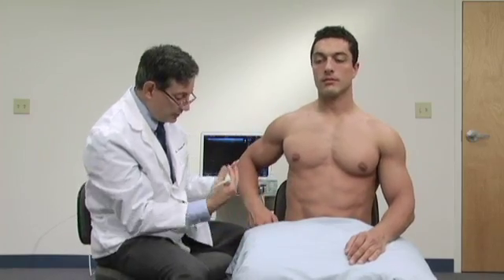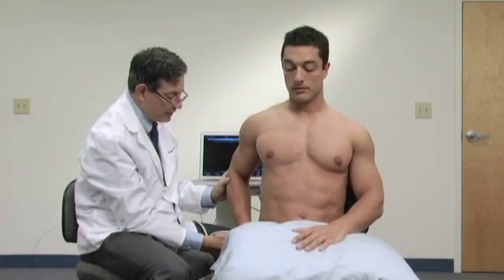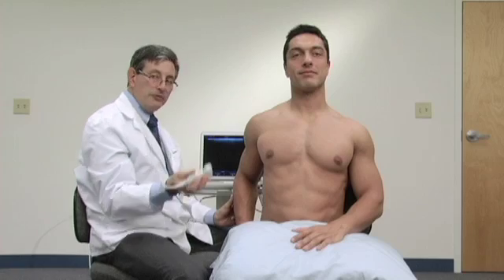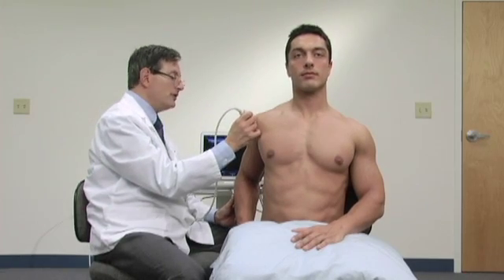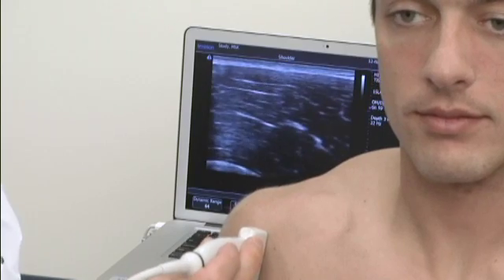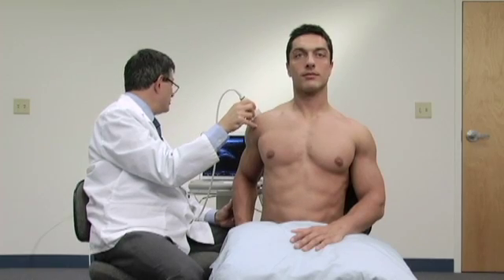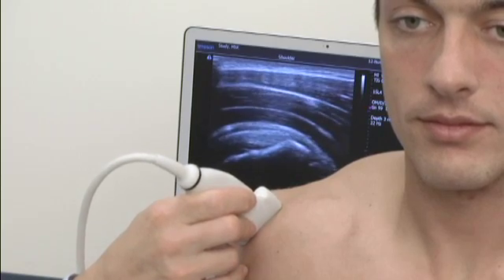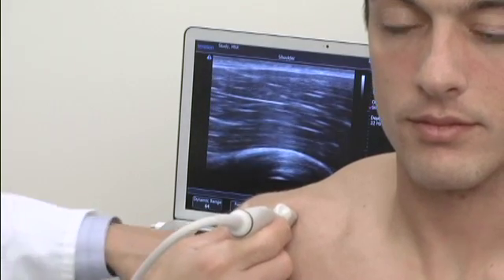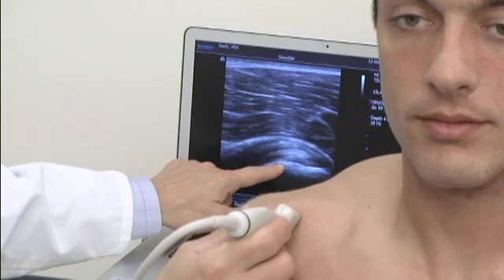I'd like you to scoot a little bit towards me on the chair so that your arm can come back here. Place your hand on the outside of your hip and bring your elbow in a little bit. Now if I put the probe in the same position I had it before, I will not see a good view of the supraspinatus tendon. I'm halfway between the neutral position and the full CRASS position, so it should be right about here — halfway between the two — and there it is. In this modified CRASS position, it will be easier for me to move anteriorly, or medially, and find the biceps tendon. Right here on the image we're beginning to see the biceps tendon in this long axis.